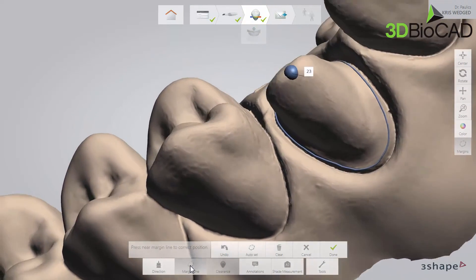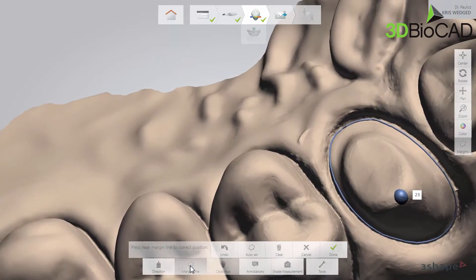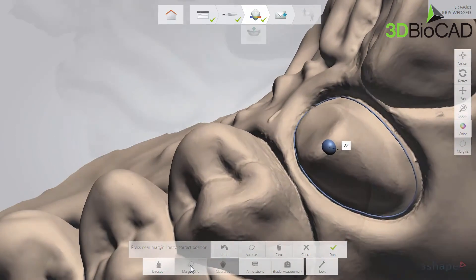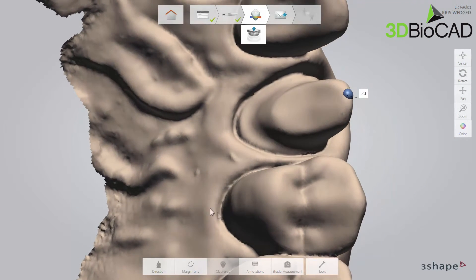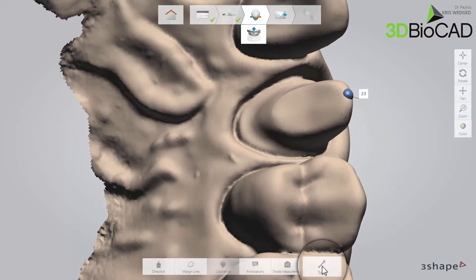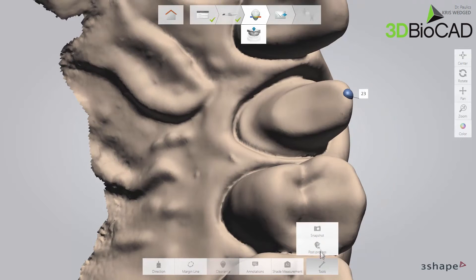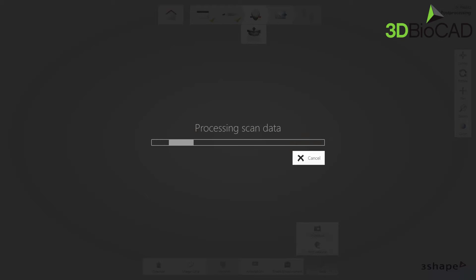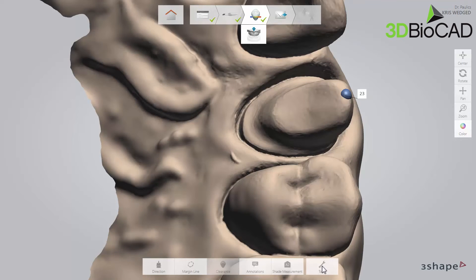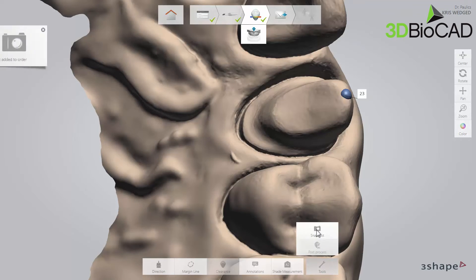If you wish, you may also see the difference on your own system. On the Analyze page, take a snapshot of the preview — select the Tools menu on the lower panel and choose the Snapshot button. Then go to the Tools again and post-process. Finally, take another snapshot by selecting the Tools menu on the lower panel and choosing the Snapshot button.